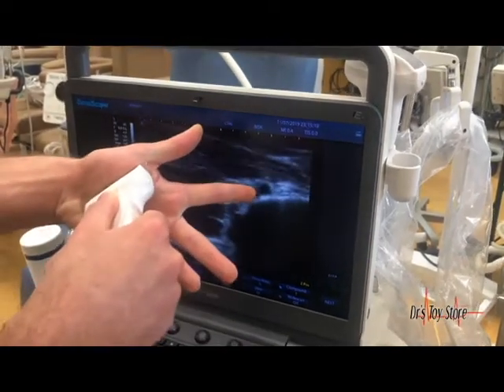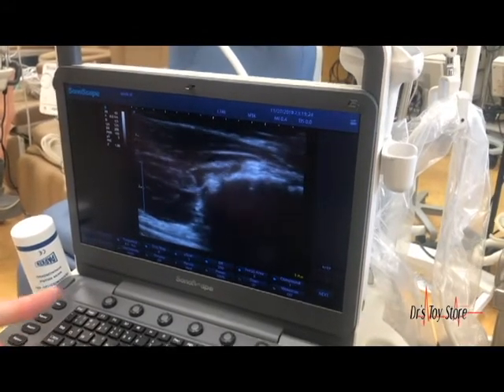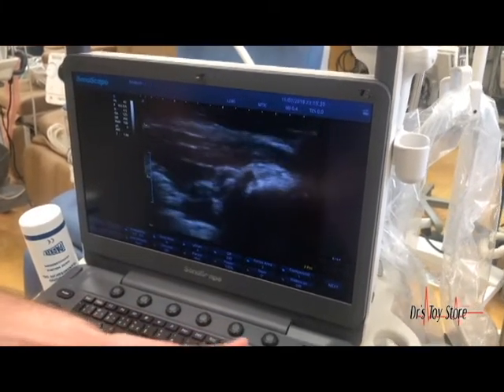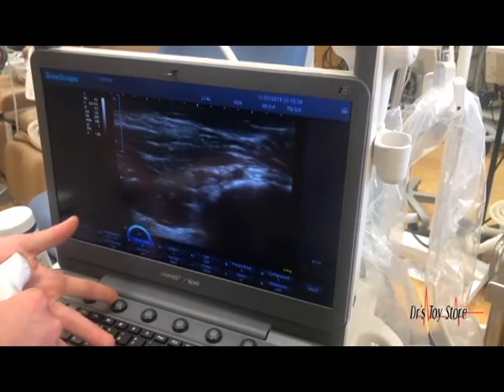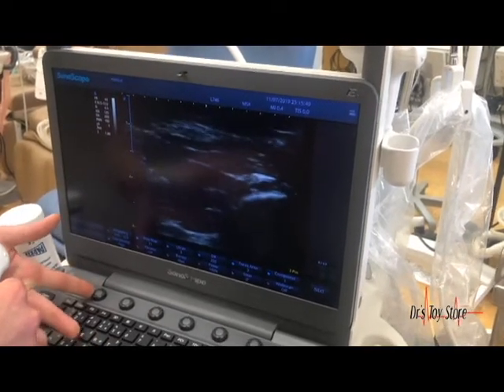There's my beating artery there in the hand. These systems are truly amazing — you can increase the focus area and change the gray map, chroma, and line density.